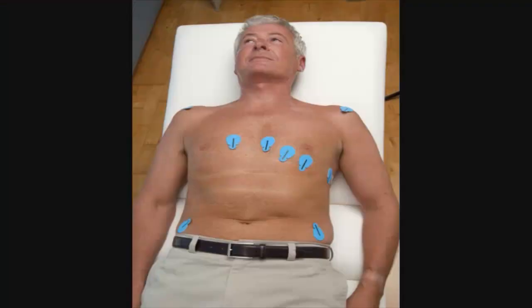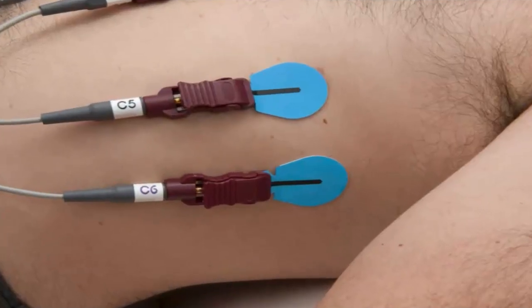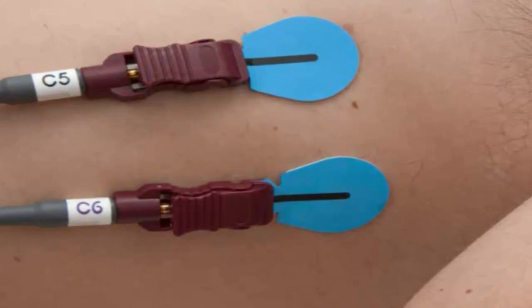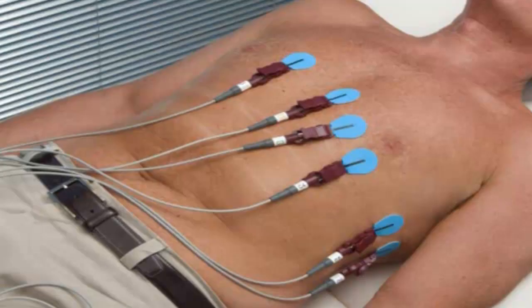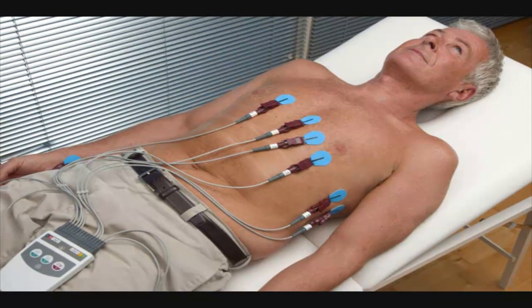First, place the electrodes onto the patient at the appropriate electrode sites on the chest and limbs. Electrode preparation of the skin is always recommended, especially if the patient is hairy or moisturiser has been used. All of the electrode sites are clearly labelled, and you can see the individual labels on the banana plugs.